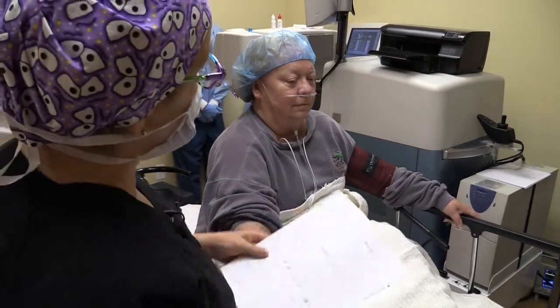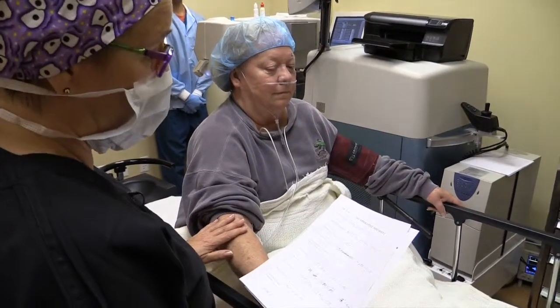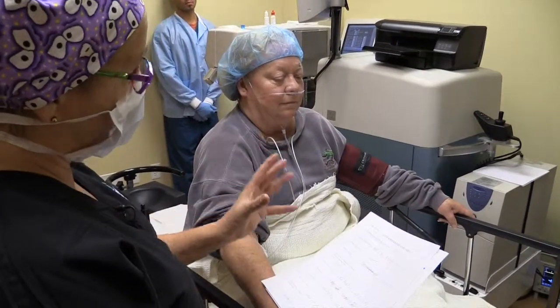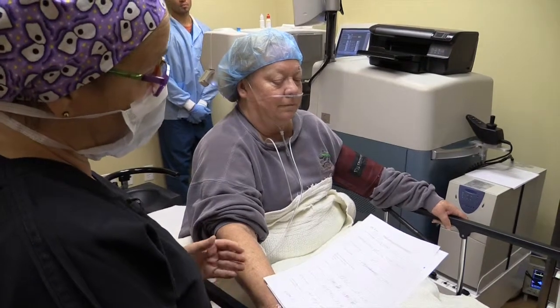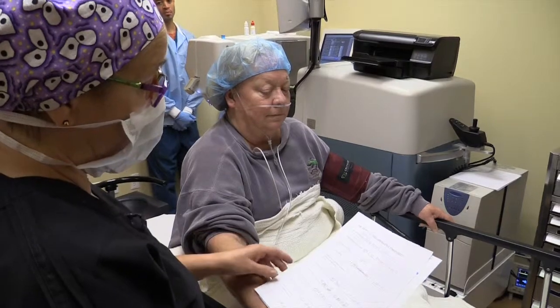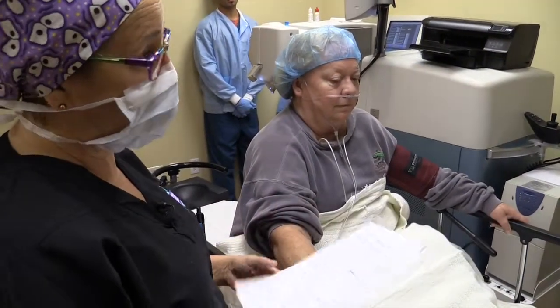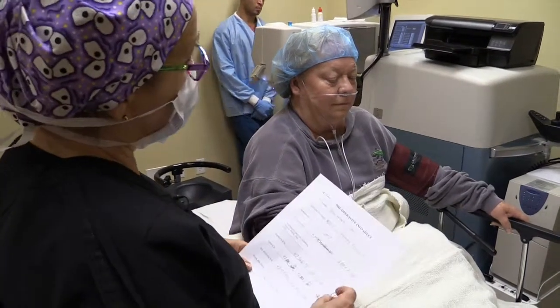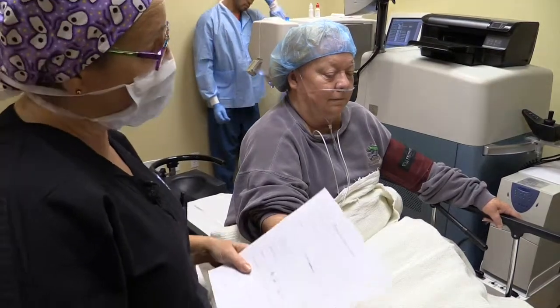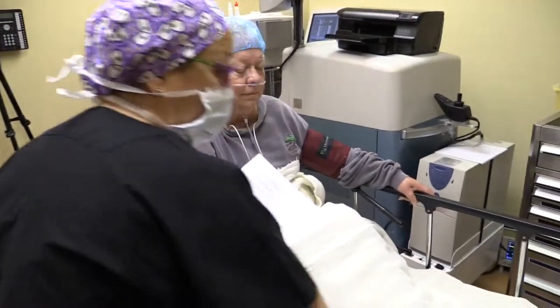In order to do that, we have measured the shape of her cornea at least 4 different ways. We've looked at it with her natural refraction. We've looked at it with what we call corneal topography, which measures the overall shape of the eye. We've looked at it with what we call manual keratometry measurements, and we've looked at it with what we call IOL Master, which is optical biometry, looking at the shape. So by then we get all these numbers, and then we use our training and education to determine how exactly to best treat that amount of astigmatism, and that's what we're going to work on today.